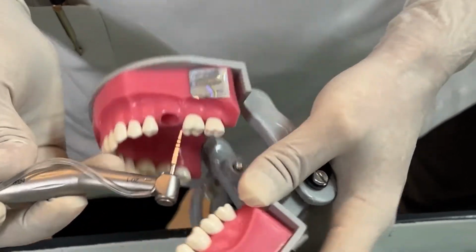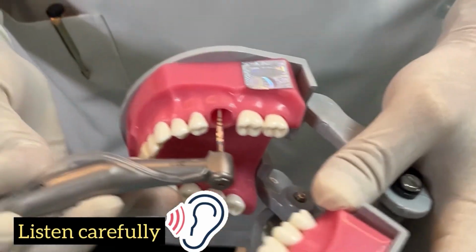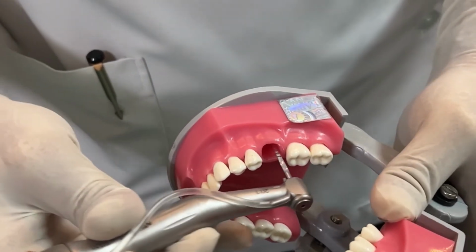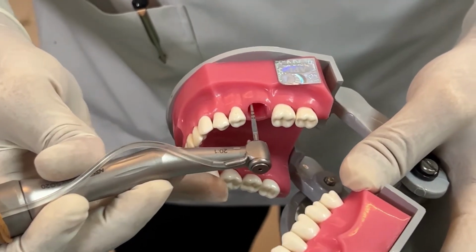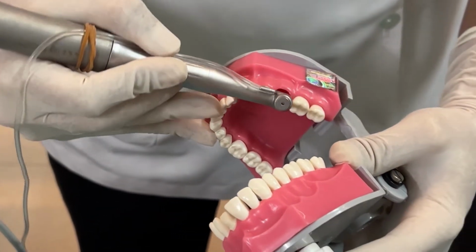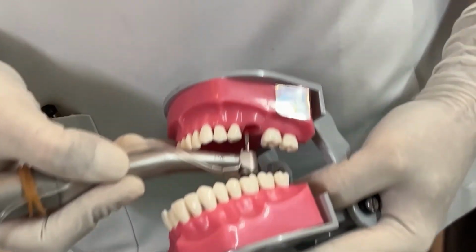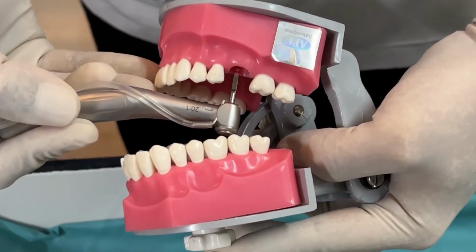I will repeat: mesiodistal positioning in the center. We are talking about single tooth implant placement. Mesiodistal angulation straight or parallel to the anterior tooth, so it can be straight or slightly mesially tilted following the curve of Spee. And finally, buccolingual angulation should be such that the back of the handpiece is roughly falling in the central fossa of the antagonist.